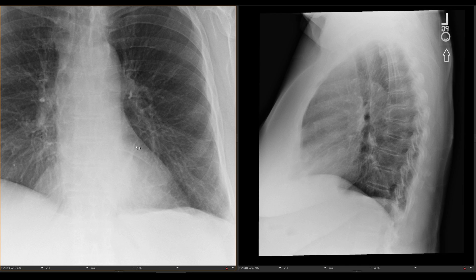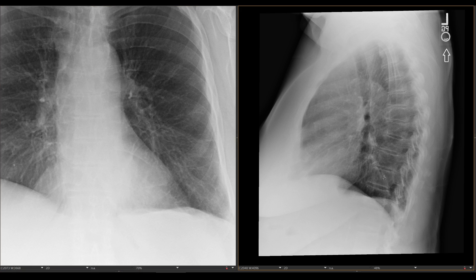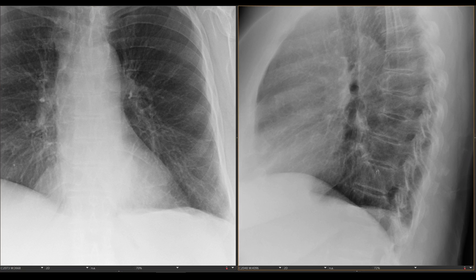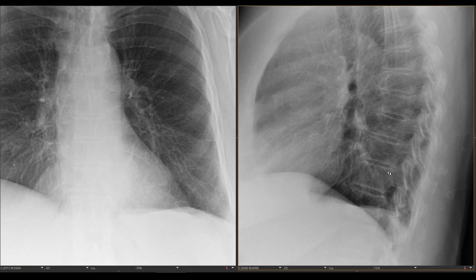Another reason why we can tell that this is in the left lower lobe is if you look at the descending aorta — it obscures the descending aorta. So therefore it must be in the left lower lobe. And even though I know where it is, I can't really see it on the lateral view. So at this point my differential for this chest x-ray would be either a pneumonia or a lung cancer.